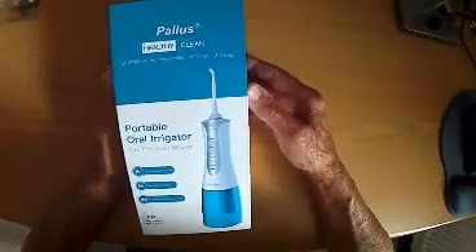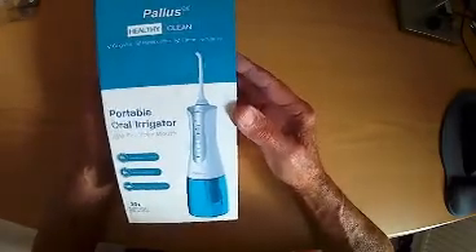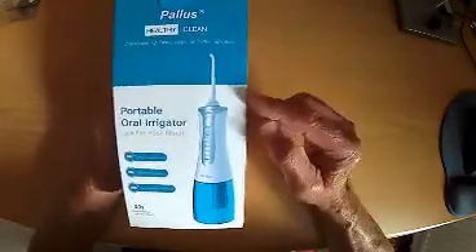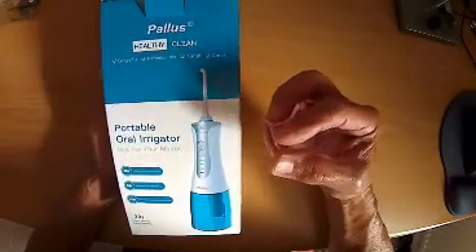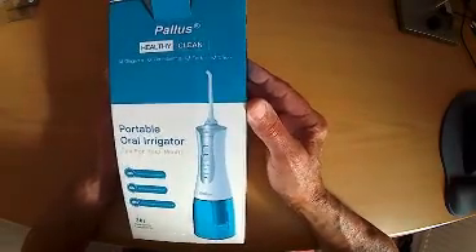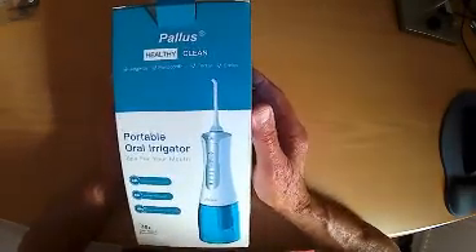This is the Pallus Portable Oral Irrigator, or as described, a water jet flosser — a very interesting device. Basically it's used to fire a jet of water through a nozzle in between each tooth to clear any food, and hence it's called a water jet flosser because it takes the place of manual flossing.